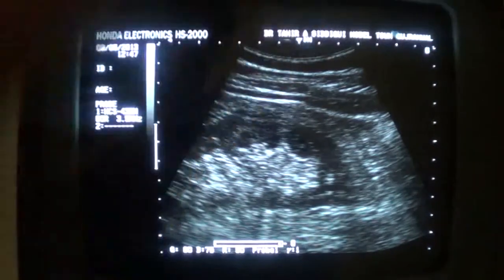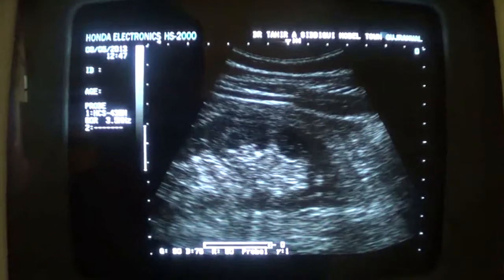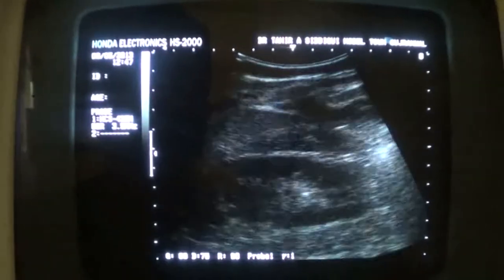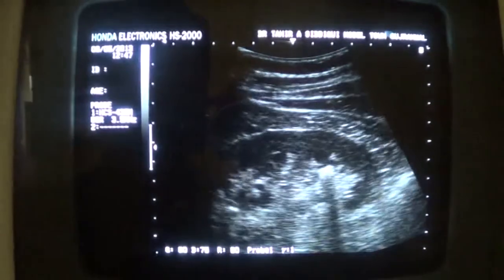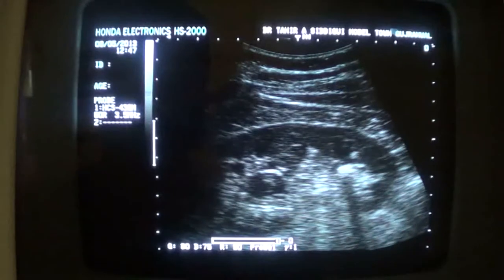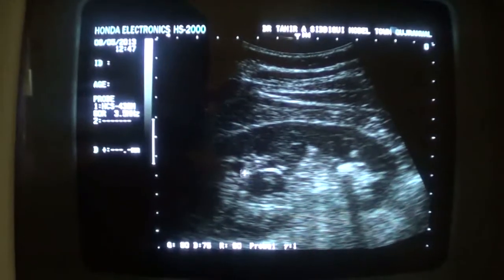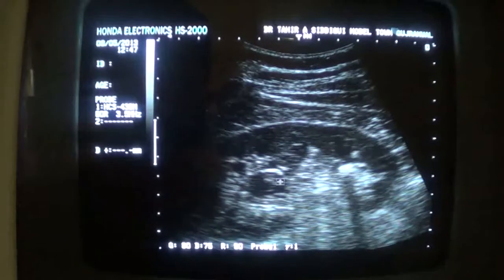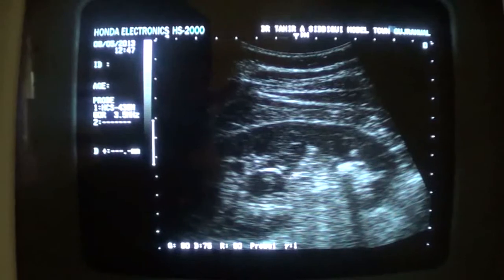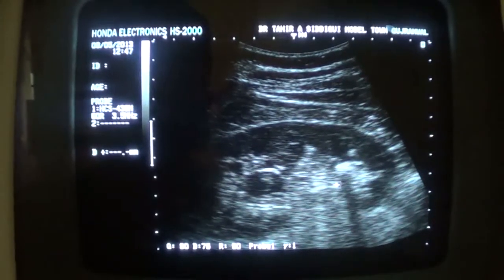Now this is really a bilateral condition. So let's see the right kidney also. Now this is the right kidney. Again, you will see the same picture. Whereas there is a calculus, this is the true calculus within the central sinus echo complex, and you can see that the central sinus echo complex is slightly muffled, but it is not as bright as it should be.